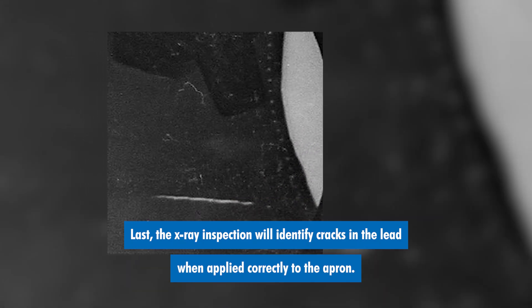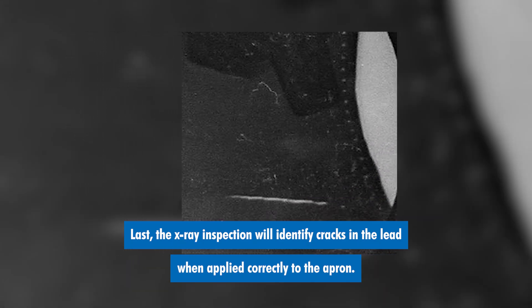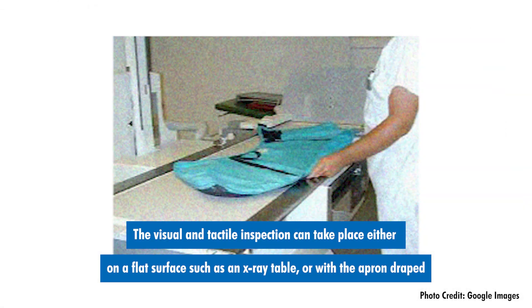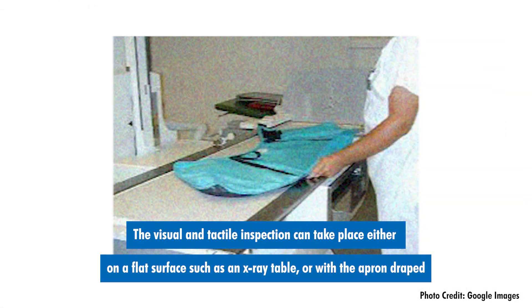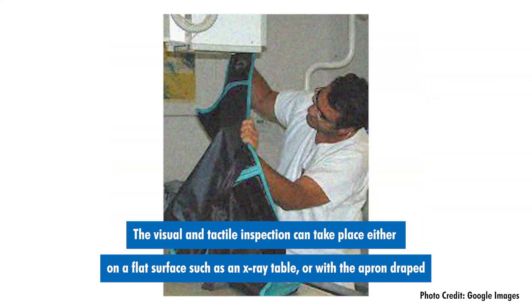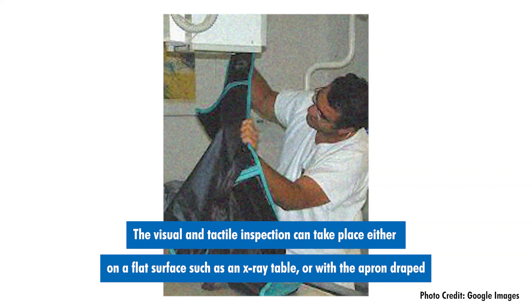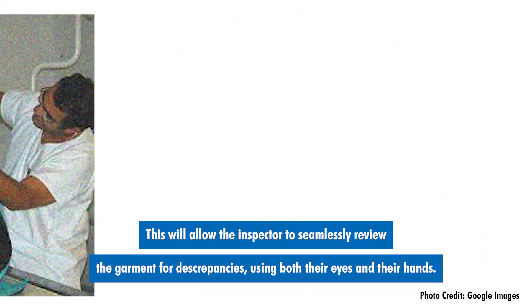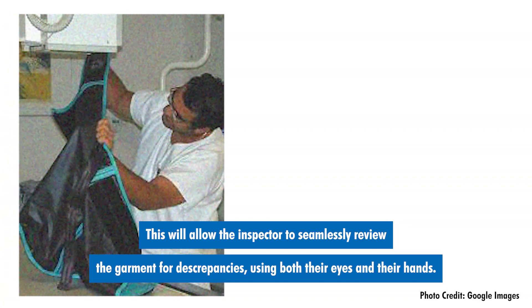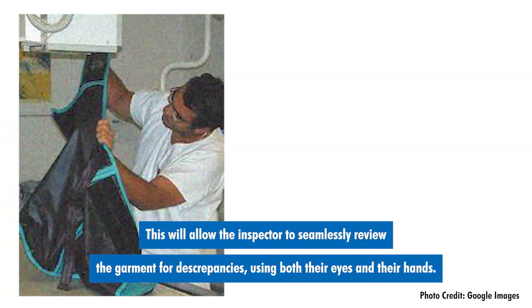Last, the x-ray inspection will identify cracks in the lead when applied correctly to the apron. The visual and tactile inspection can take place either on a flat surface such as an x-ray table or with the apron draped or hanging from a customized rack. This will allow the inspector to seamlessly review the garment for discrepancies using both their eyes and their hands.